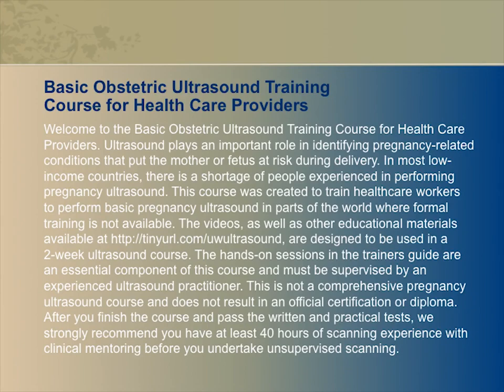Ultrasound plays an important role in identifying pregnancy-related conditions that put the mother or fetus at risk during delivery. In most low-income countries, there is a shortage of people experienced in performing pregnancy ultrasound. This course was created to train healthcare workers to perform basic pregnancy ultrasound in parts of the world where formal training is not available. The videos, as well as other educational materials, available at tinyurl.com/UW Ultrasound, are designed to be used in a 2-week ultrasound course.